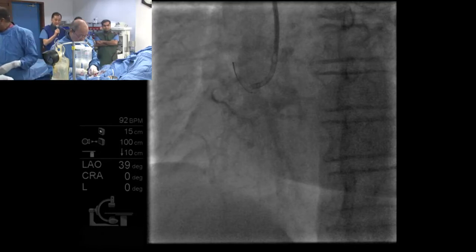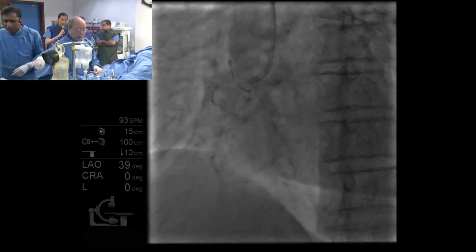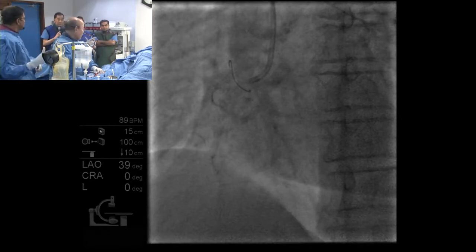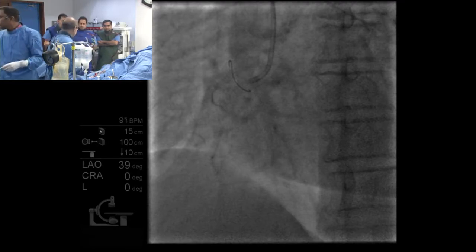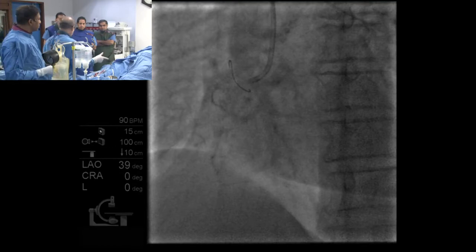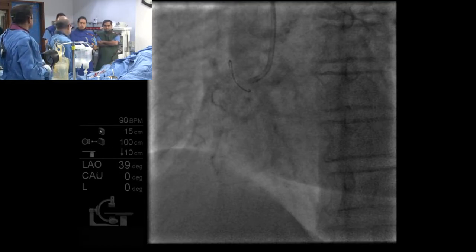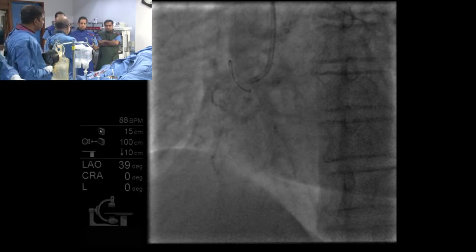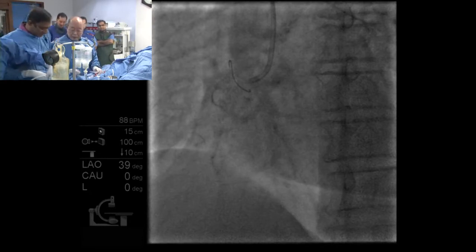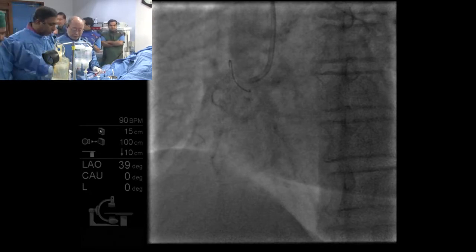Balloon line? Yes. Maybe because of the wedging. We made a side hole, but still the side hole is not enough. We made it by needle. A 1.5 by 10.